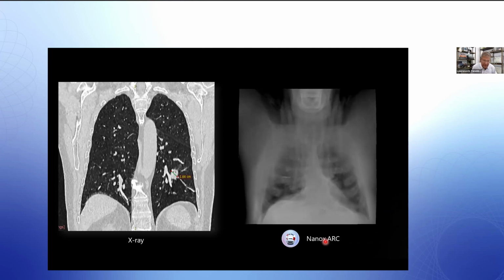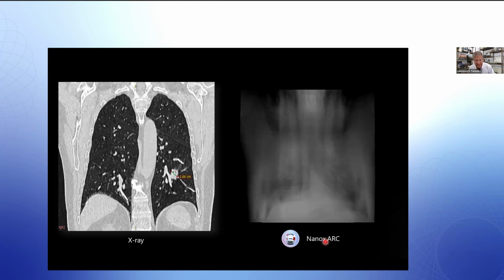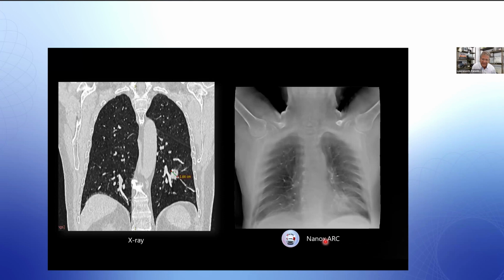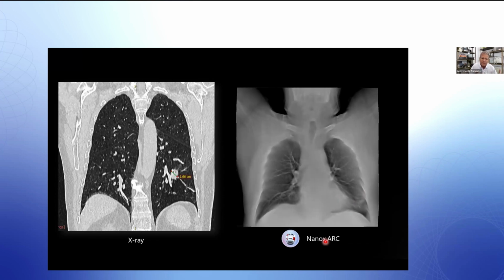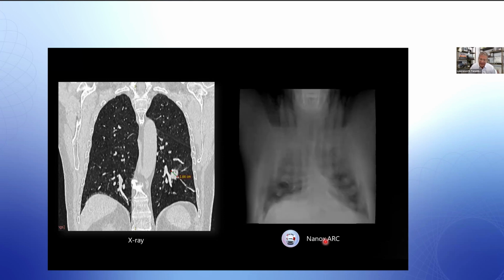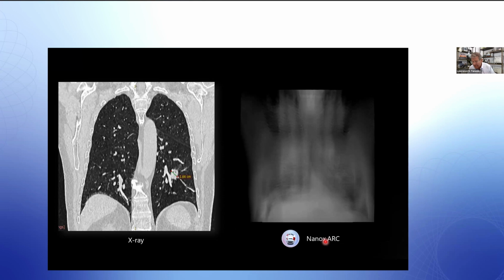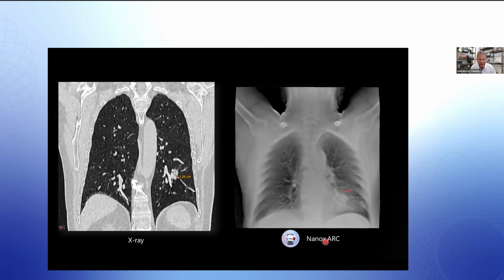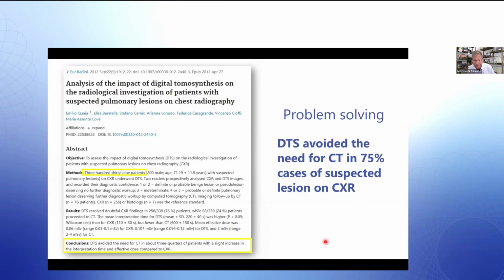Now, the CT offers information that the tomosynthesis doesn't. In many cases, it offers something, but again, access in your office. You can easily see how, if there is a question or if you had heightened suspicion because of the patient's demographics, you might be able to go the extra mile before the patient left your office.